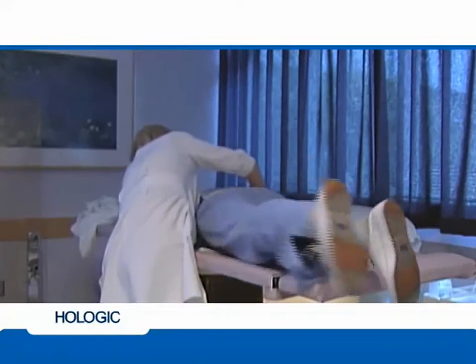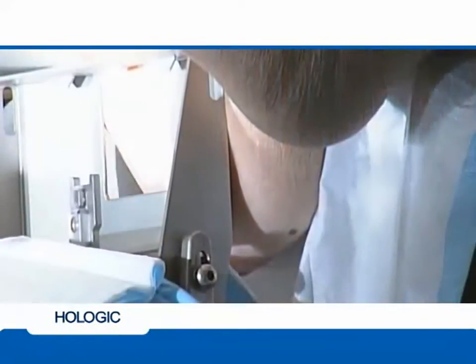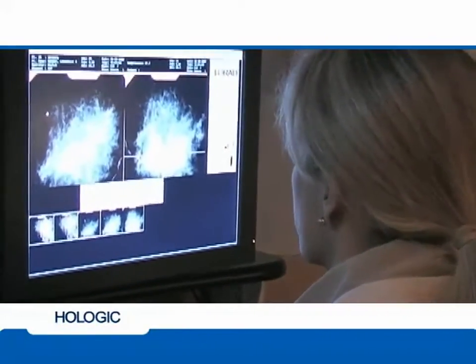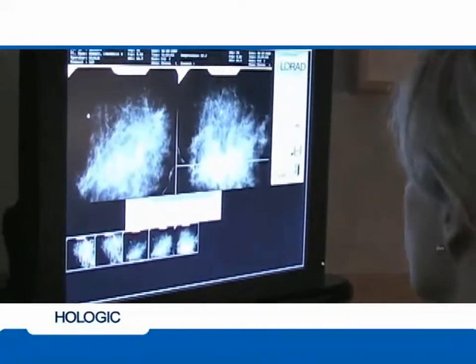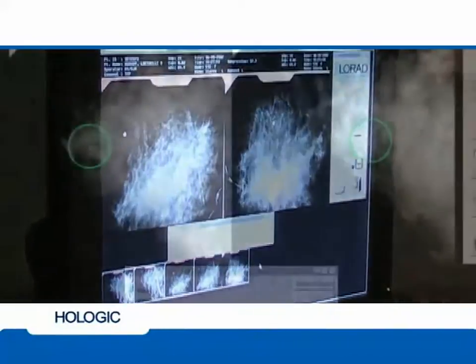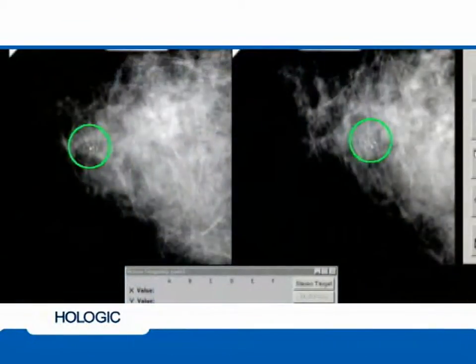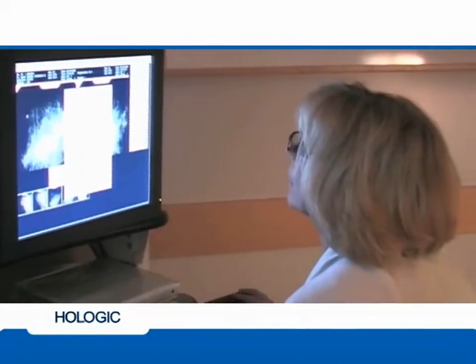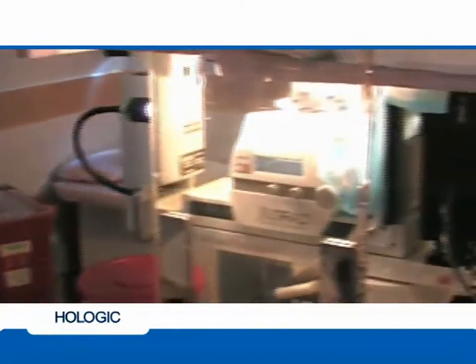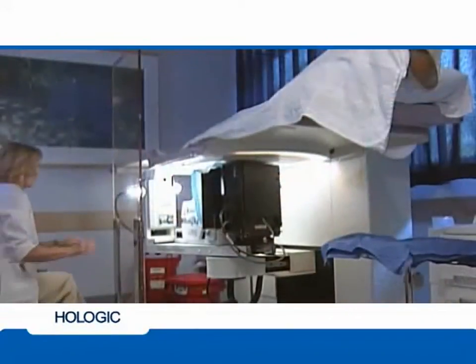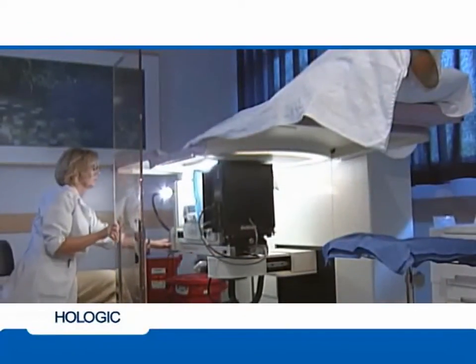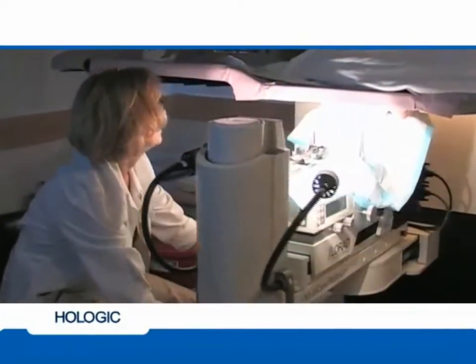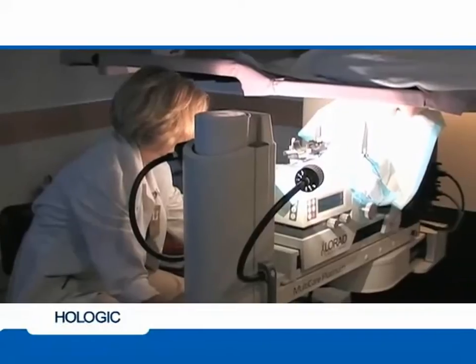Once the patient is ready, position her on the stereotactic table and compress the breast. The technologist selects the image acquisition mode and x-ray technique that is appropriate for the lesion and breast composition. A scout film and pair of stereo images are taken. Enhancement tools and filters allow image manipulation to improve contrast and sharpness and to help ensure accurate positioning and localization of the area of interest. The technologist initiates one or more stereotactic targeting sequences.